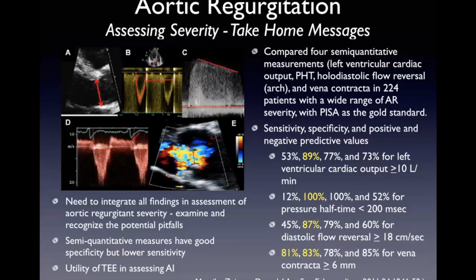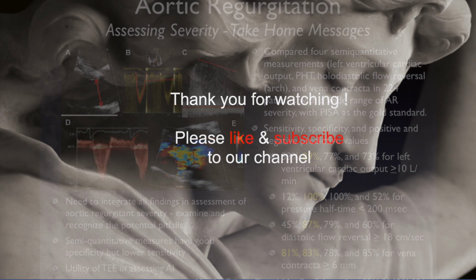So I do think we use contrast for LVEF assessment fairly routinely in our lab. Could we use it more? I think we probably could. So I think we still underutilize it as well. Recognize the challenges for both, but we definitely underutilize. Are the cutoffs of normal the same with contrast as without contrast? Yes, it's just more accurate with contrast.